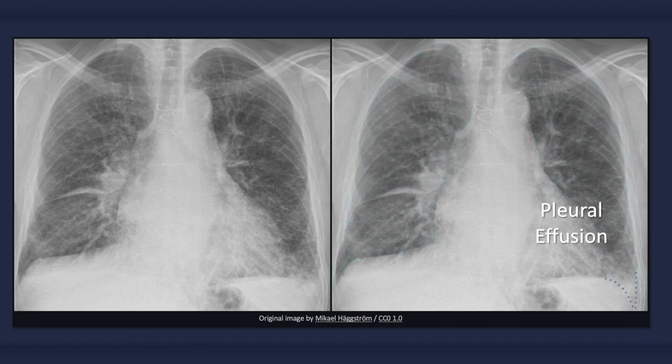Turning attention to the bottom right corner of the radiograph, note that there is a decrease in definition of the left costophrenic angle, a finding that is consistent with a pleural effusion.